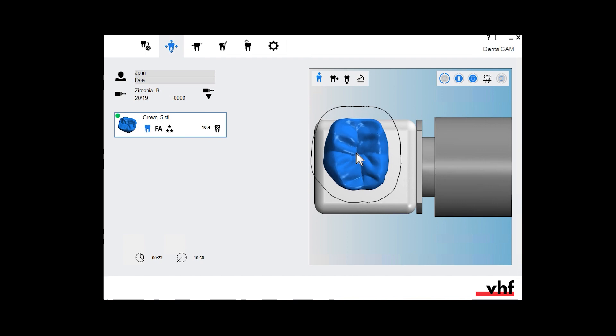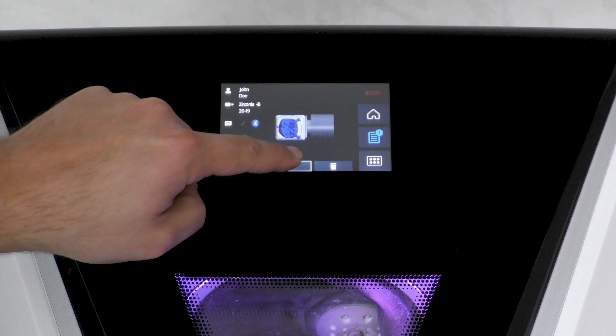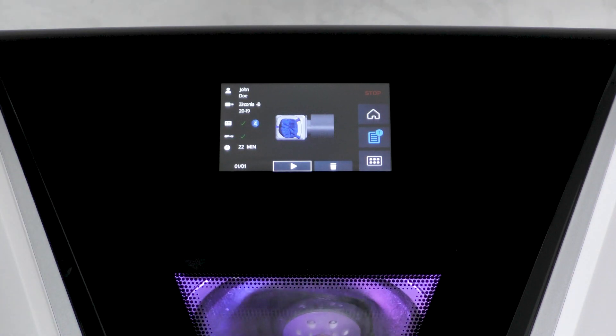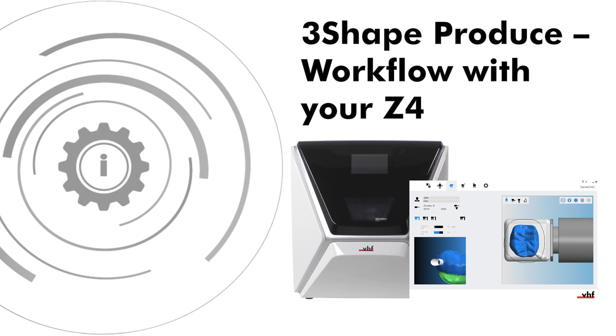In this video, we will show you how to set up and use the 3-Shape Produce Workflow with the Z4. The 3-Shape Produce Workflow replaces the CAD-CAM integration with TRIO's Design Studio.